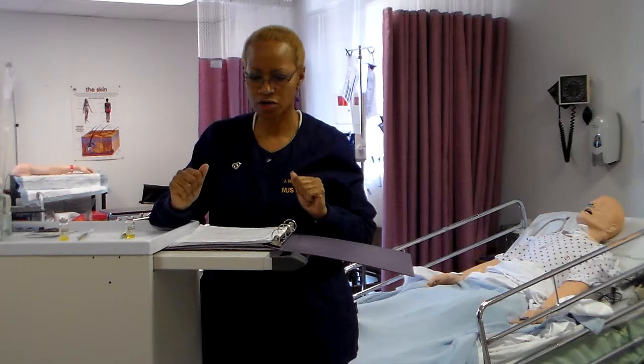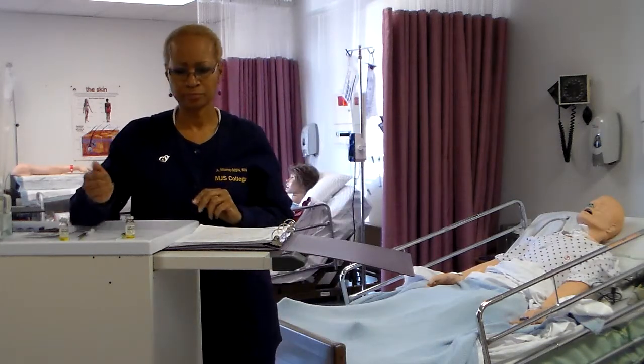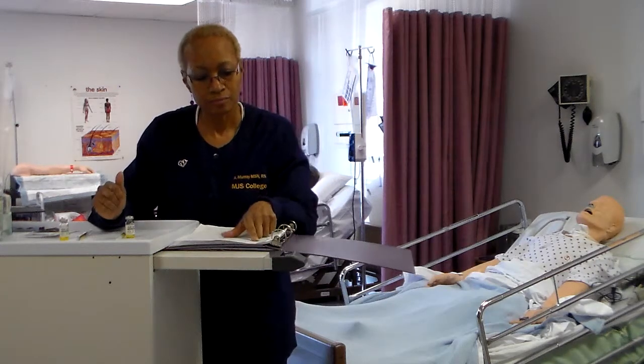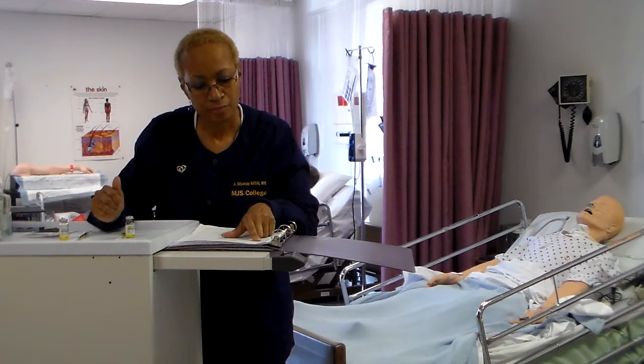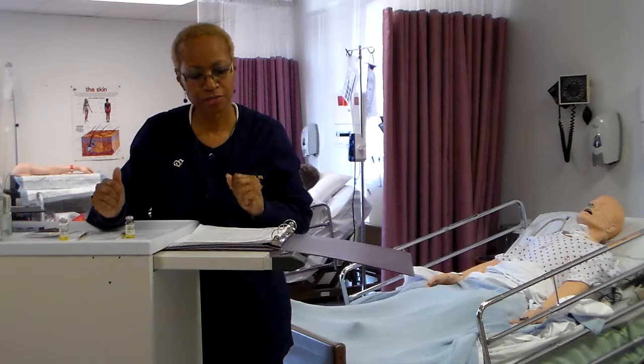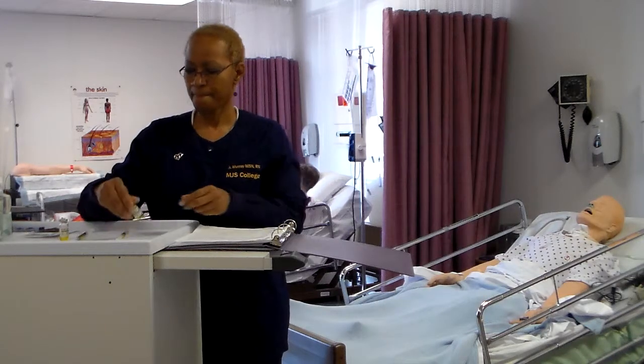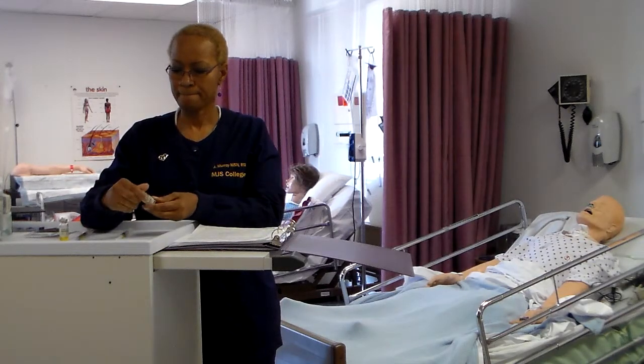Okay. MAR looks fine. Assess client's medical and medication history. Assess client's history of allergies. Okay. Allergic to penicillin and codeine. Check date of expiration for medication. Aseptically prepare correct medication dose from ampule or vial.